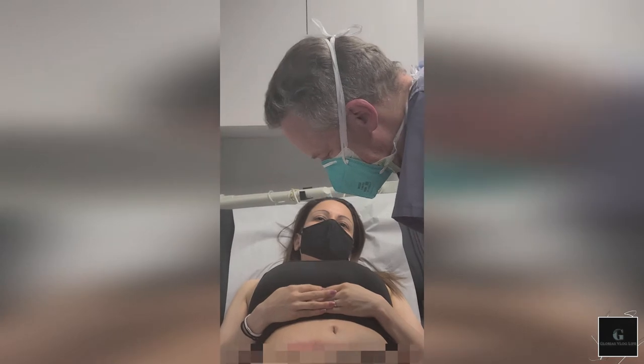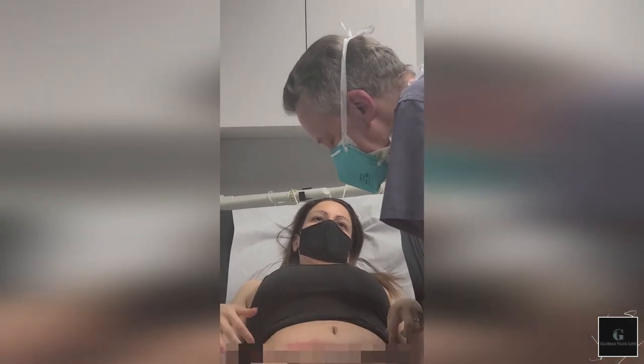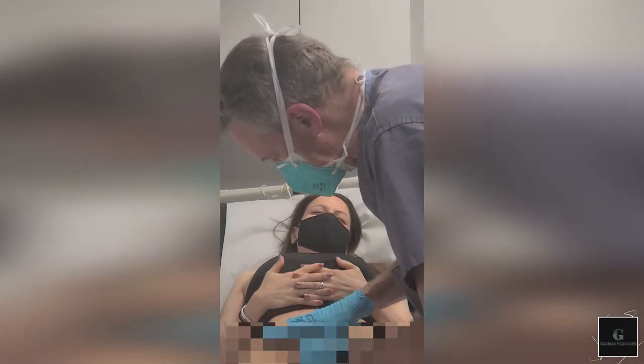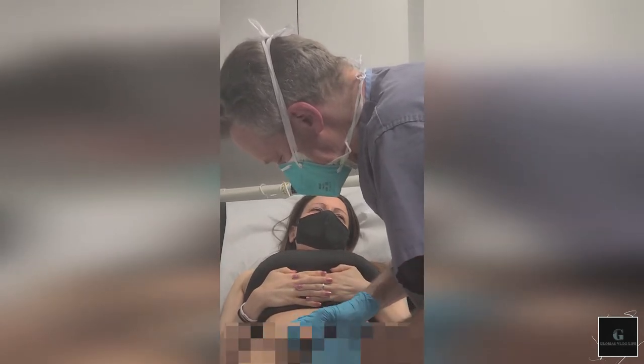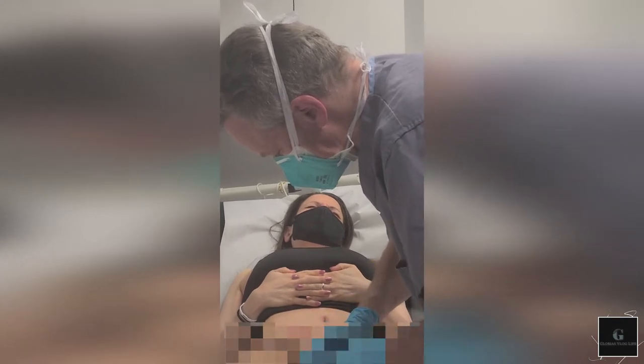Yeah, so we can get rid of these stitches for you. My question to you: when the stitches get removed, is it going to open? Should not. Are there going to be more that are open? Should not. Okay, let's do it. So you count for me: three, two, one.